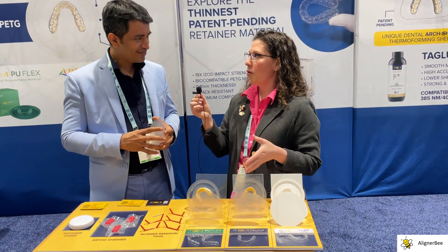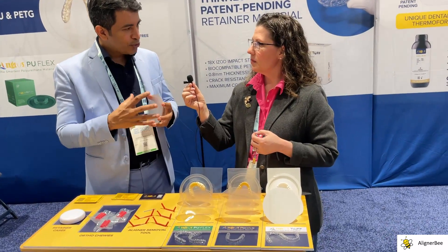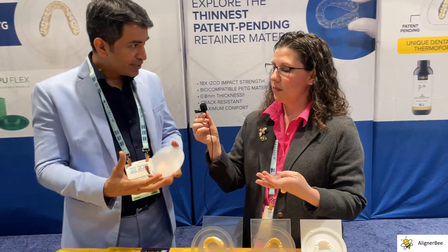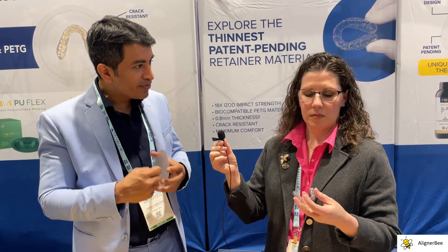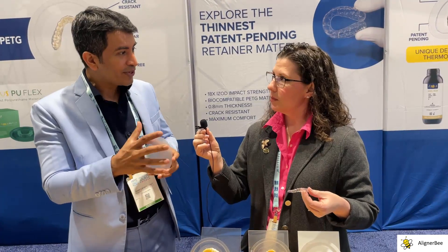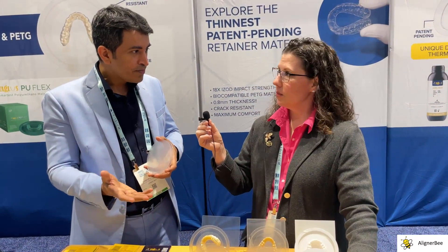Could you explain a little bit the material properties between the different types of material? Absolutely. So we have three materials. The Taglus Premium is a PETG, which has good memory for aligners because aligners need good memory to give good results. The Taglus Tuff on the other end is also a PETG, but it's 18 times stronger in terms of resilience to last as a retainer in the mouth. That's why it is a patent-pending material. It's available at a special thickness of 0.8 millimeter, unlike the 040 — this is 030 — and that gives more comfort to a patient wearing a retainer.